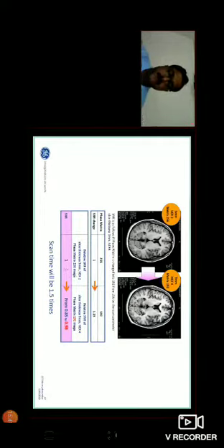The SNR is almost the same again. The relative SNR was 1 in this setup, and I reduce the slice thickness and keep the same FOV. I'm not changing my FOV. And I increase the NEX. It helps to regain my lost SNR. The NEX is one of the options to increase your SNR without losing the spatial resolution.